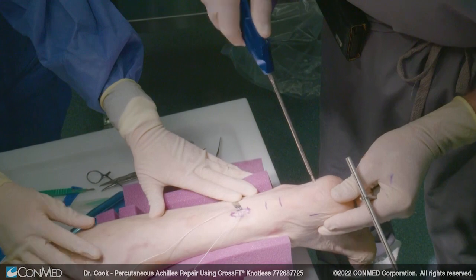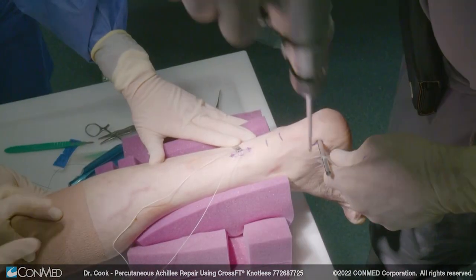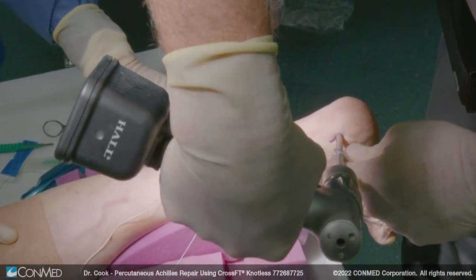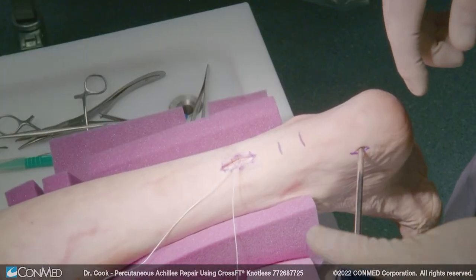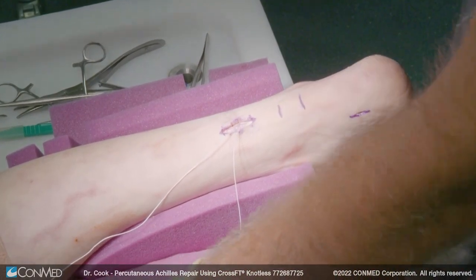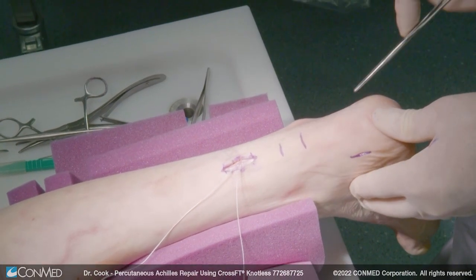You don't want to be too posterior that you're going to engage the retrocalcaneal bursa. You are just tapping it. Now we're going to drill the other side. A little hemostat can help you get going and start the tunneling process.